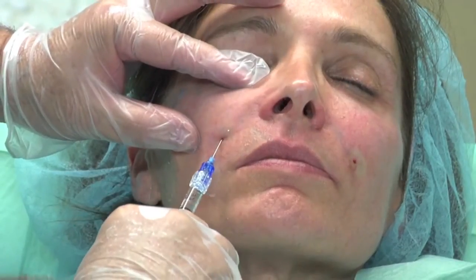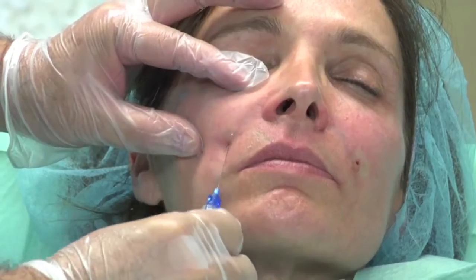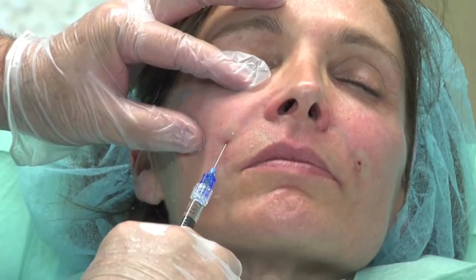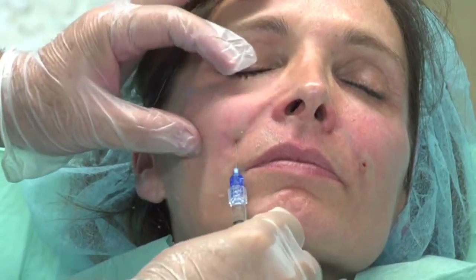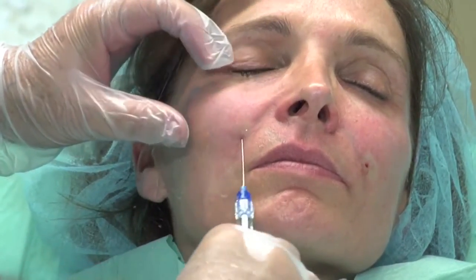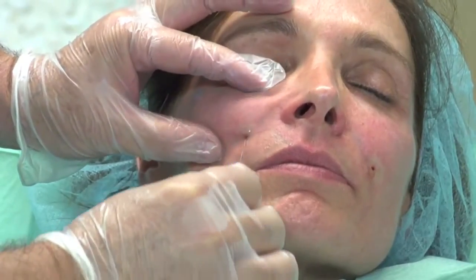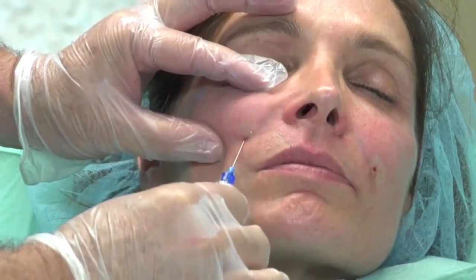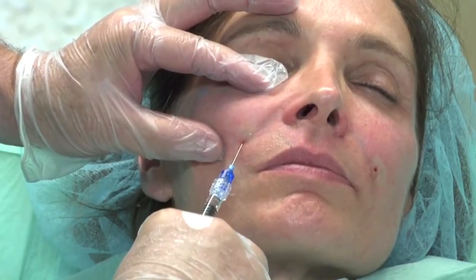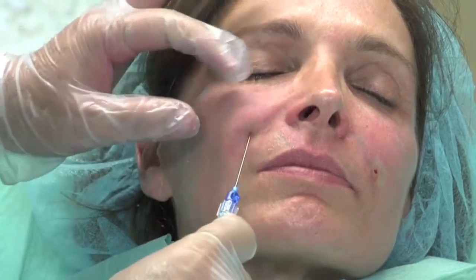It is important to keep a finger on the orbital rim to understand the position and depth of the cannula. Always be cognizant not to inject the retroceptal fat pad with this technique. Higher G', small particle size filler or small aliquots of fat are effective in this region. Be cautious with large particle filler, as this can cause lymphatic disruption and clumping, which may affect the aesthetic outcomes.